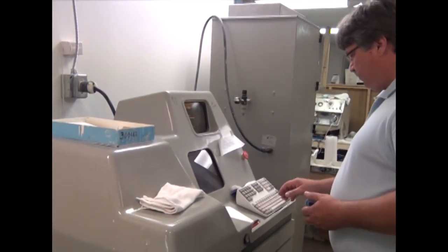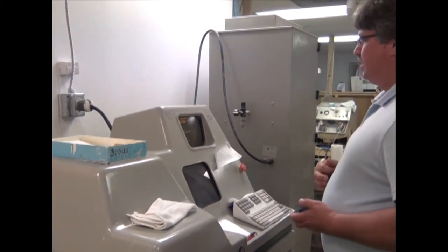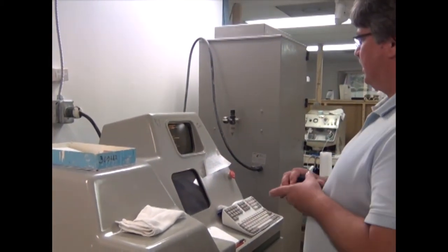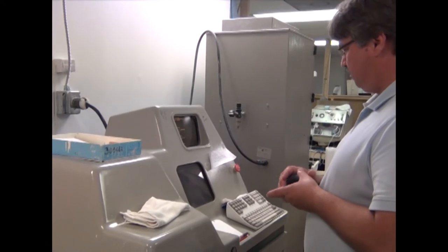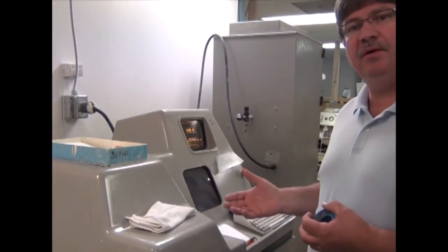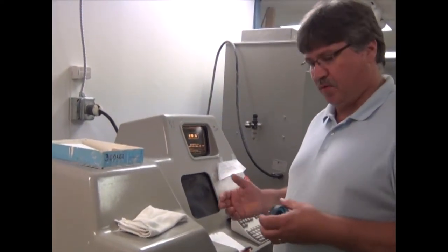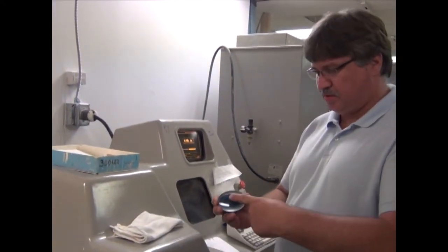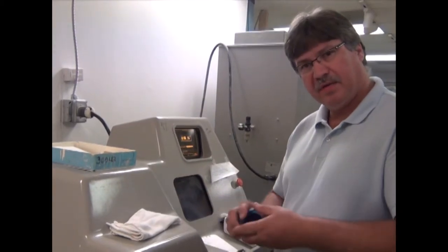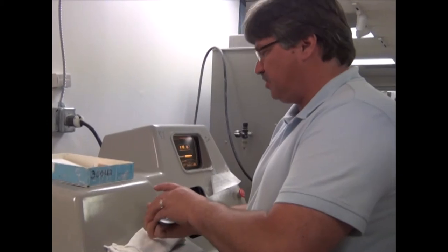This machine right here is called a generator. Push a little button here to get it to boot up and open up. It generates optical power, not electrical power. What it does is take and cut the lens away so that you get exactly the prescribed prescription that you are going to have.